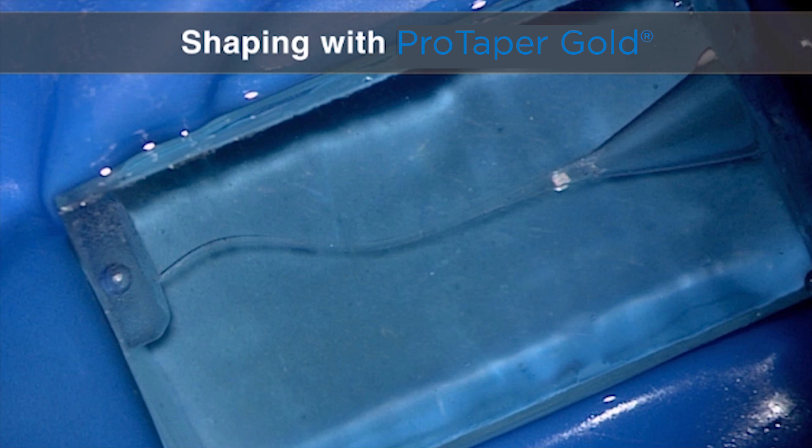Let's look at shaping this canal with ProTaper Gold. Remember, shaping is the most straightforward procedure probably in clinical endodontics, but that's after glide path management. Why do I use a plastic block? A plastic block allows us to look at an instrument and observe when it cuts, where it cuts, and how much it cuts. We could use an extracted tooth, but you would see nothing. Many instructors like to show extracted teeth or a 3D printed model, and those are really good exercises for colleagues around the world in workshop participation, but this is a very good challenge because it is a multi-planar canal.